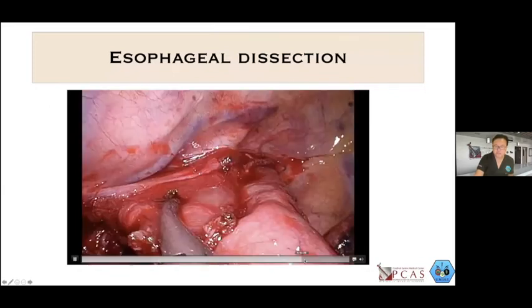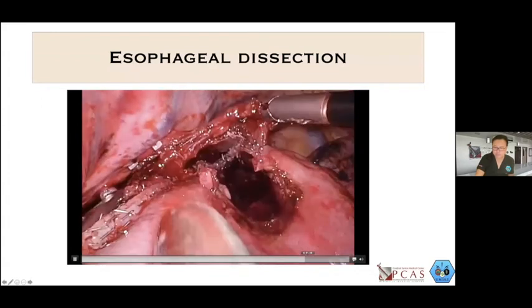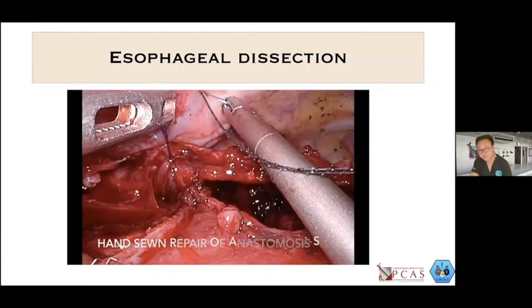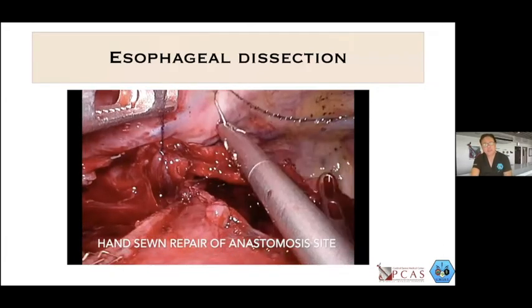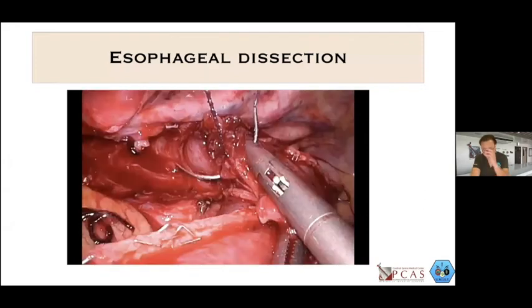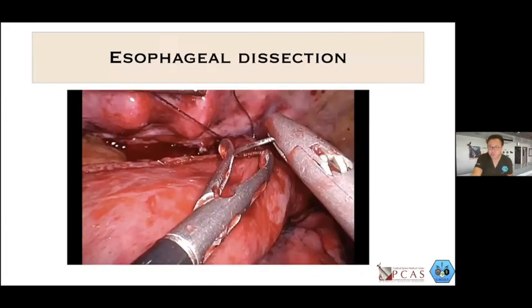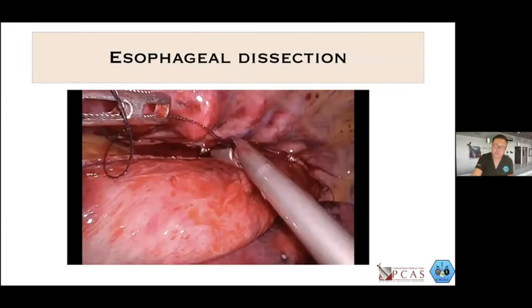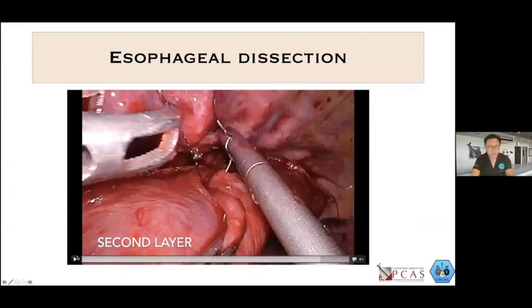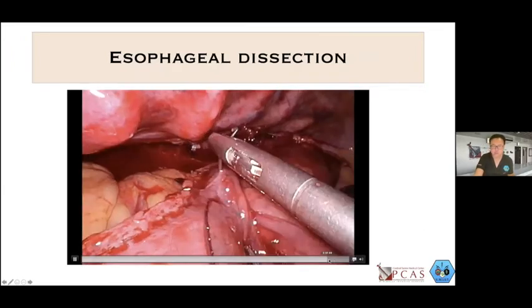And after a side-to-side stapler was done, then we do our hand sewing. In some of our esophageal surgeries, sometimes because the esophagus is quite small, I would end up just suturing the reconstruction. I think it's one of the skills that you need to have if you're doing your procedure.